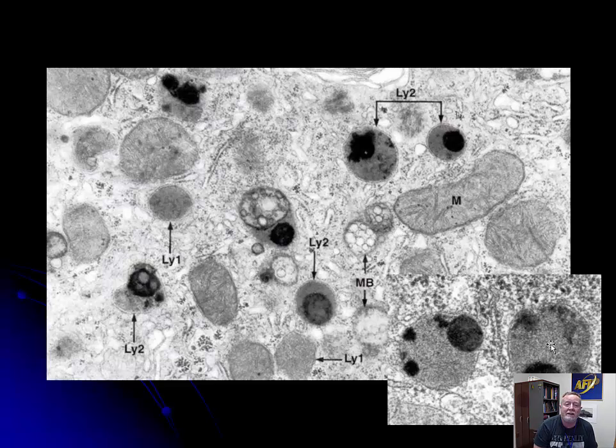Okay, so you will see this in cells where there is a widespread injury to cell membranes. So you may see this in cases of vitamin E deficiency. You will see this certainly in conditions such as ceroid lipofuscinosis or intestinal ceroidosis. A lot of the things which used to be called lipofuscinosis now are ceroidosis because it's a pathogenic process rather than a natural breakdown process. So anything that injures cell membranes, you're going to see a lot of this material.